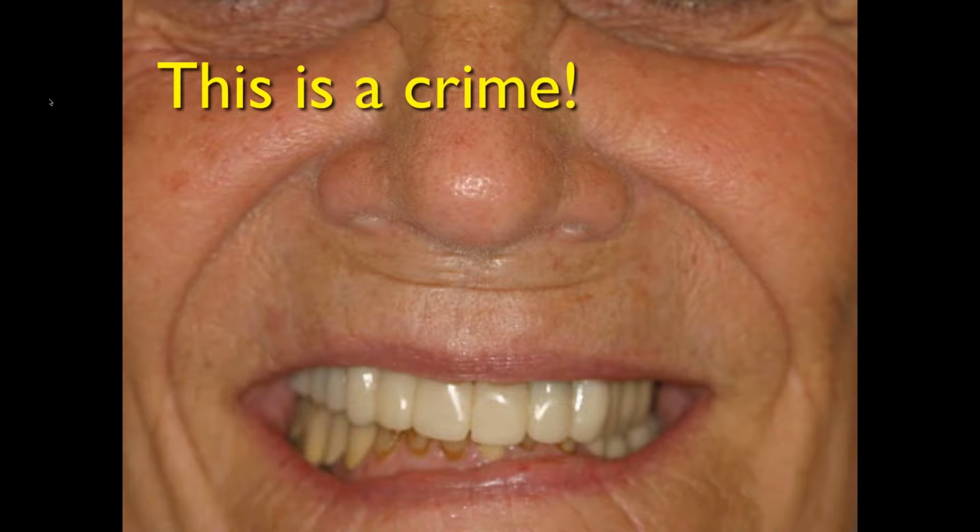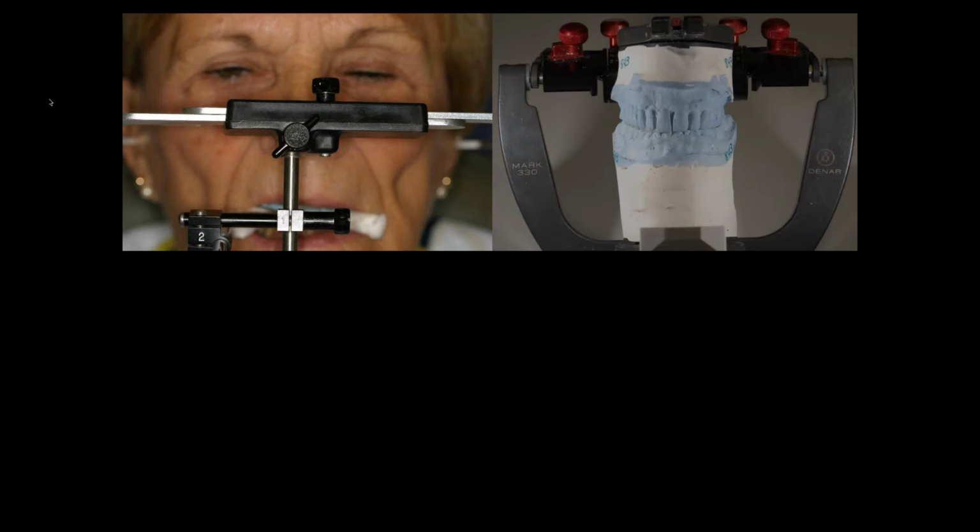And the doc sent me the picture of the face bow. He sent me the models. We mounted the case up. We saw that we were short on this side, which is what we perceived from our mounting. I took a look at this picture, went, yeah, that looks okay, right? It's kind of parallel to the eyes, although where are the pupils? I don't really know in this picture.